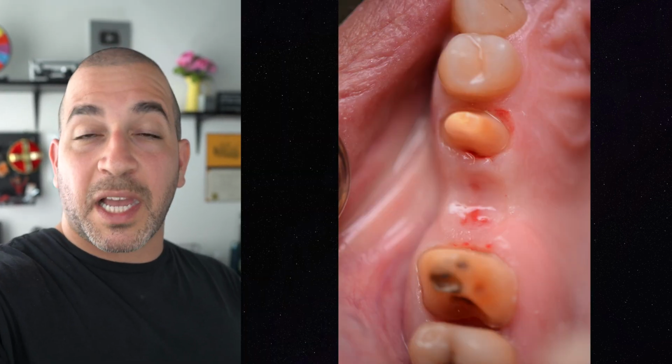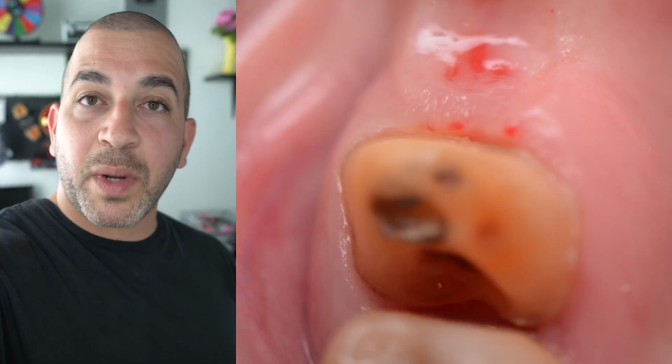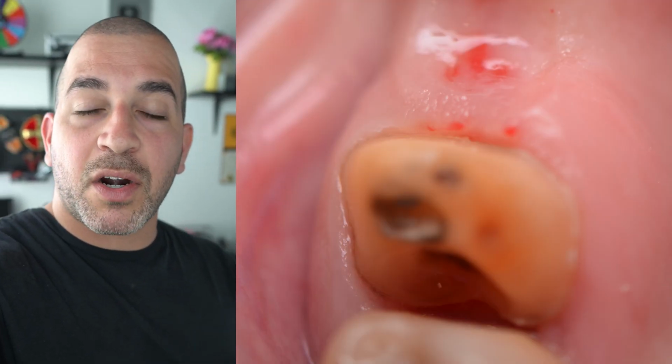This is what our tooth looked like after removing all the cavity. Although it looks dark, the tooth has a hard stopping point. I am pretty confident that he's going to be pain-free and that a root canal is not needed.